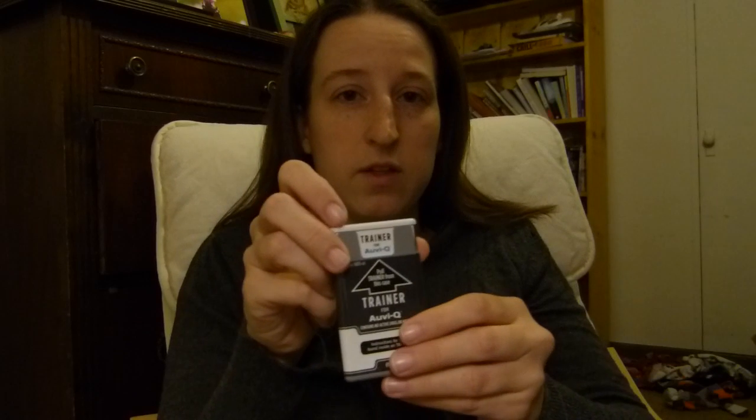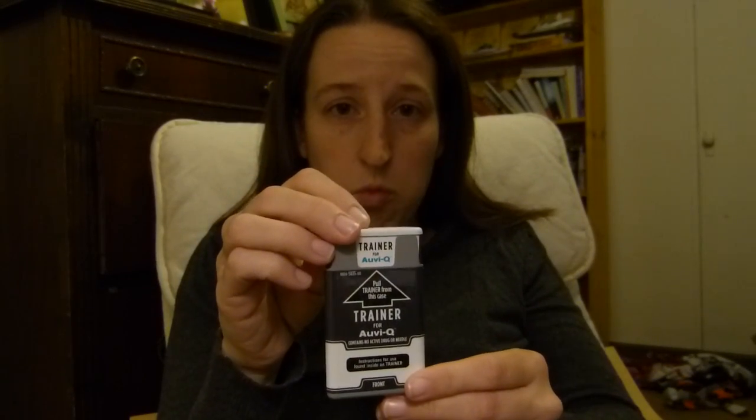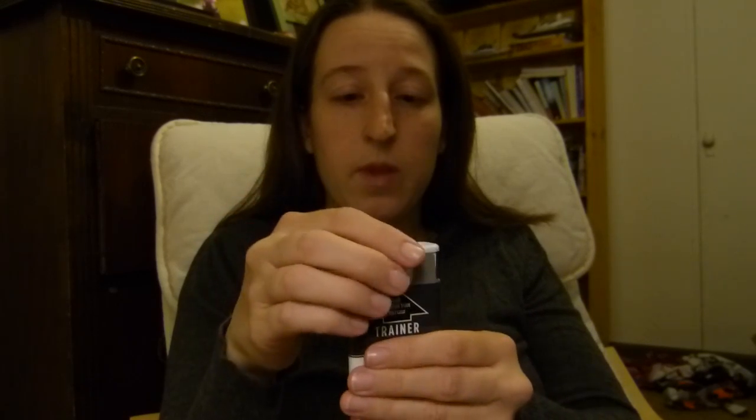But the whole bit about it being a training model, obviously the real one wouldn't say that. And the real one doesn't look like this. It's gray and white because it's the training model. The real one, the adult is like a bright red and the kid's is a blue. So they do have a junior in this new model as well. And when Bennett's expires in November, we're totally getting this kind. So it fits in your pocket, nice size. And all you do is you pop it out like this.